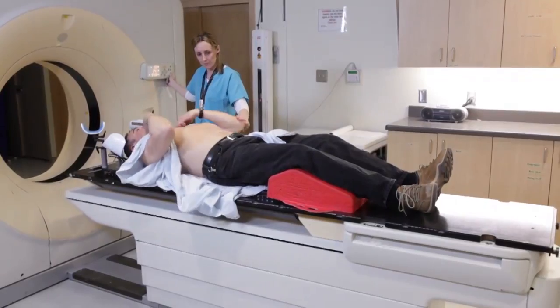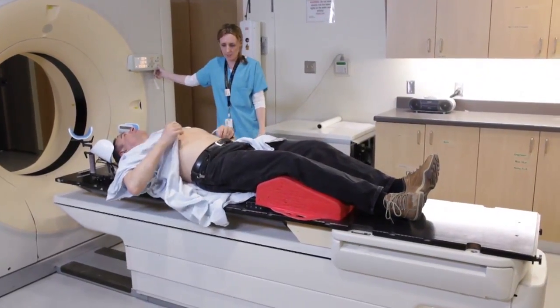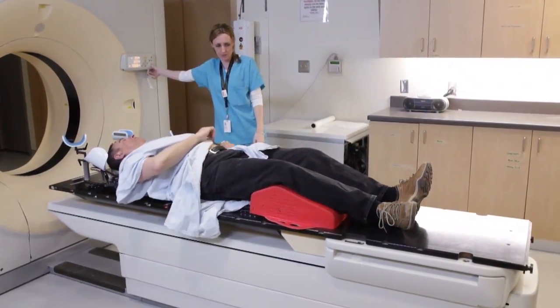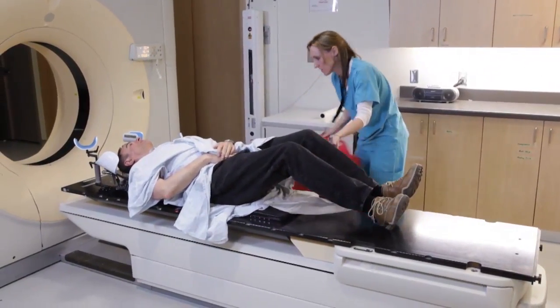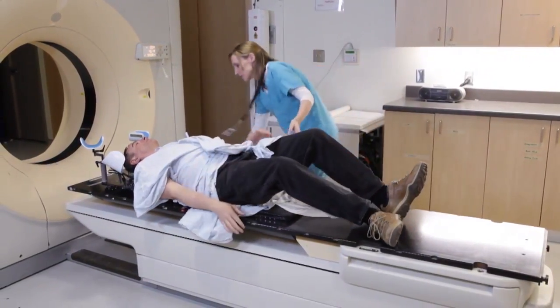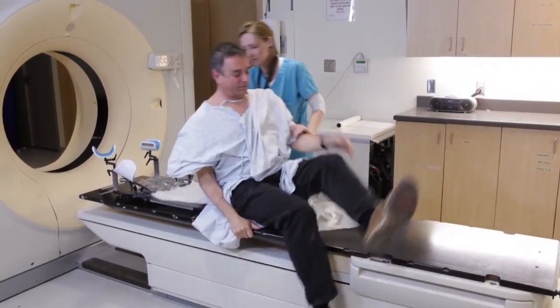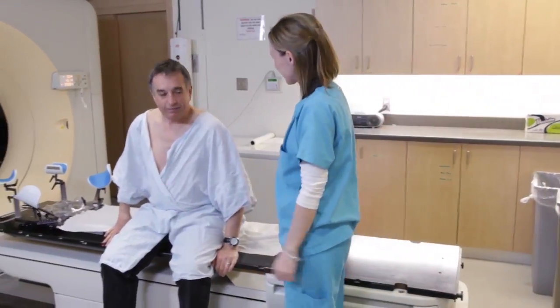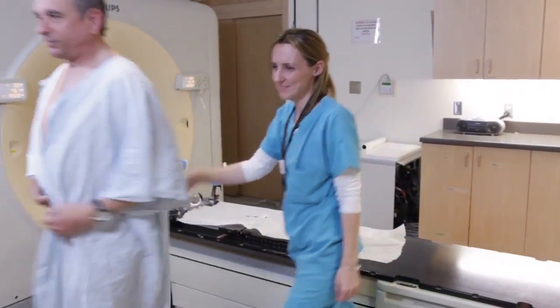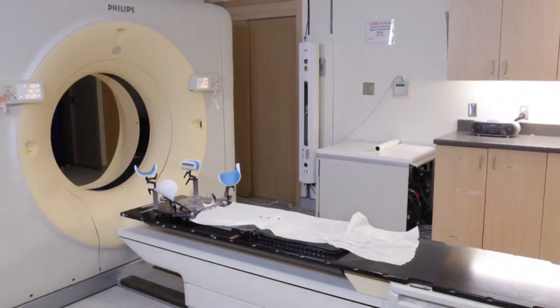Once you've done the CT simulation, we will contact you to set up your first radiation treatment appointment. Once the scan is done, you will get a phone call from our booking office and they will let you know when your treatments are to start. Another radiation therapist — a planner — will work very closely with the radiation oncologist to devise a plan that is best suited for you, and it goes through a whole bunch of quality checks before it's delivered to the treatment unit for you.